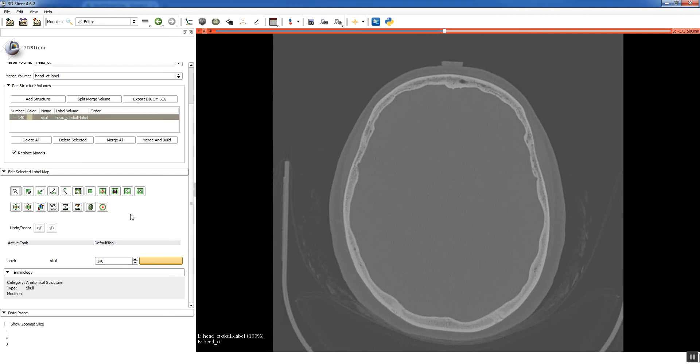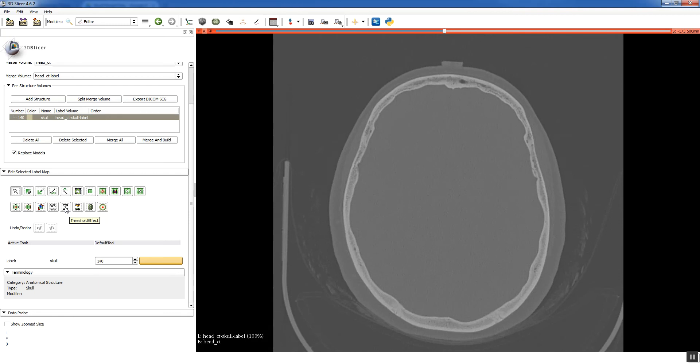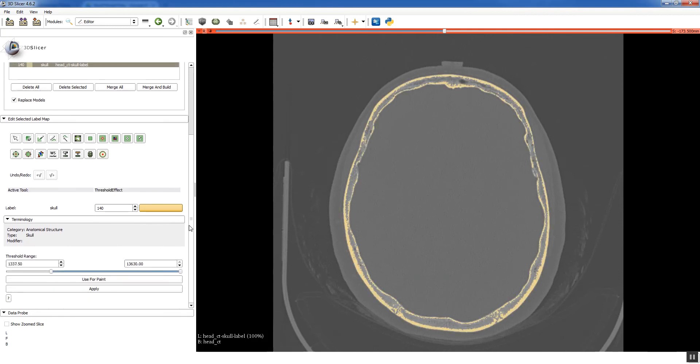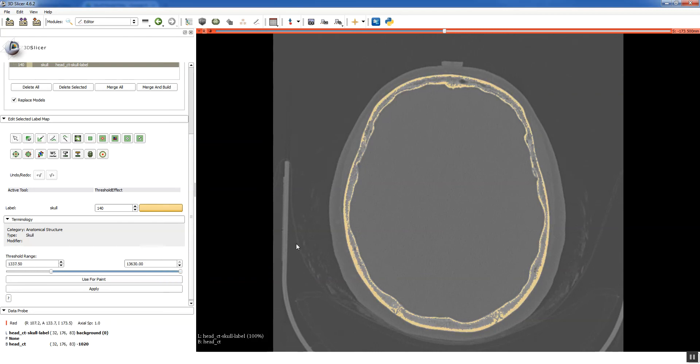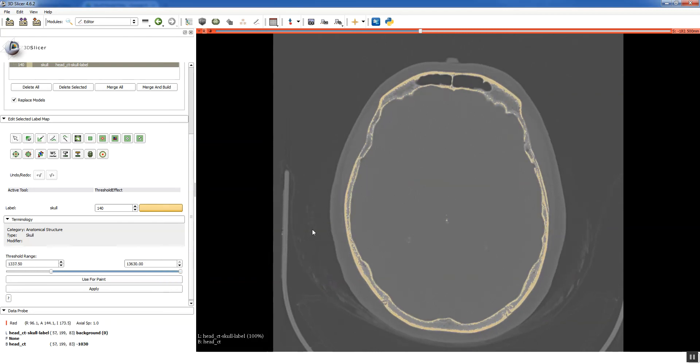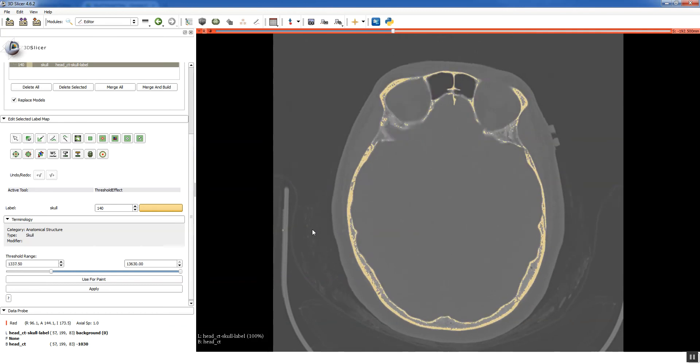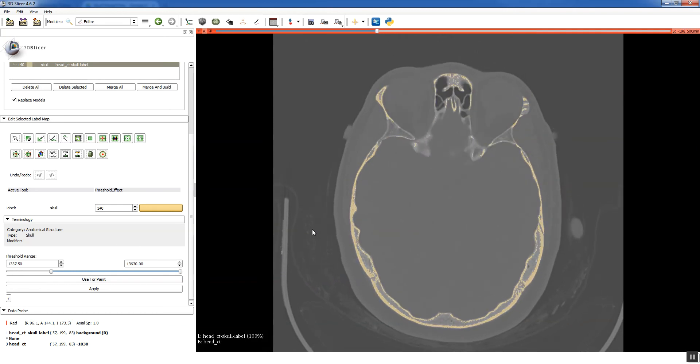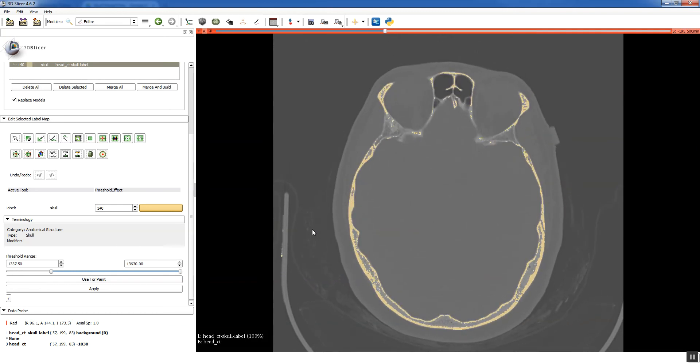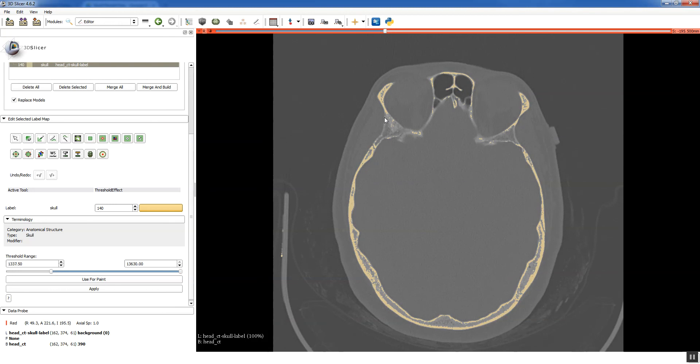And then we'll talk about a couple other values that show up in the data probe once we start segmenting. But time to start segmenting. So the first step is typically what is called thresholding. Thresholding just basically says mark all of the pixels that fall between a range of values. If we click the threshold effect button and then scroll down, you can see there's a threshold range here. So if you scroll down, you can see that it has automatically selected quite a bit of the bony structures. But one of the things you'll appreciate is that the central marrow is actually not very dense, and it's not selected, and it's not even selecting parts of the outer cortex that you can see here.